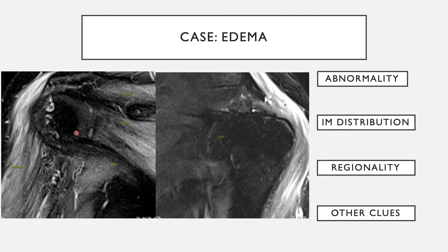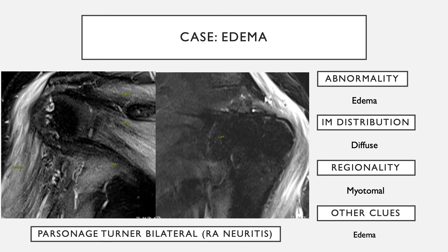In contrast, another case shows diffuse shoulder muscle edema involving all muscles of the upper extremity bilaterally — the supra- and infraspinatus and all muscles. When you have bilateral edema in this situation, one thinks more likely of a diffuse neuropathic event. This was bilateral Parsonage-Turner syndrome from rheumatoid arthritis-related neuritis. When you see diffuse muscle edema affecting multiple muscles involving an entire extremity, start to think of a more proximal cause for denervation.